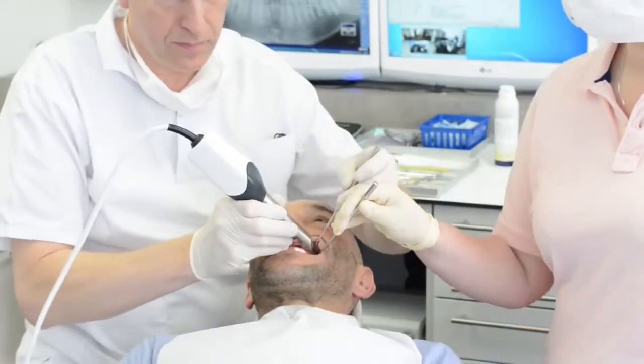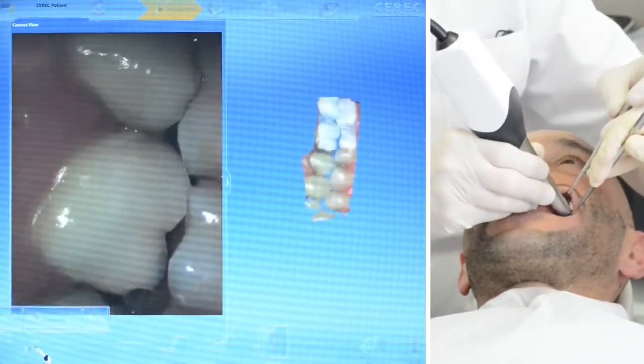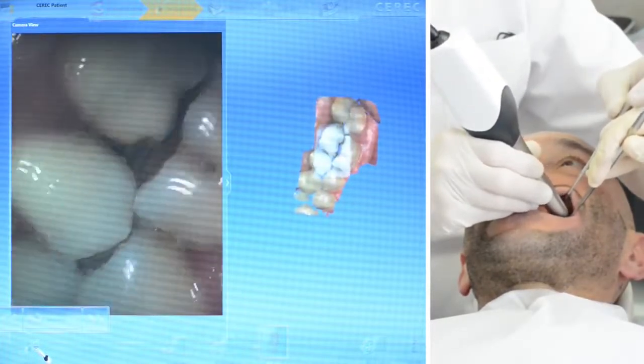The Omnicam requires no powder and is optimized for scanning natural tooth structures and gingiva. This results in precise 3D scans in natural color.